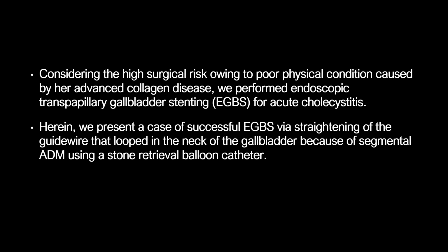Herein, we present a case of successful endoscopic transpapillary gallbladder stenting via straightening of the guide wire that looped in the neck of the gallbladder because of segmental adenomyomatosis using a stone retrieval balloon catheter.